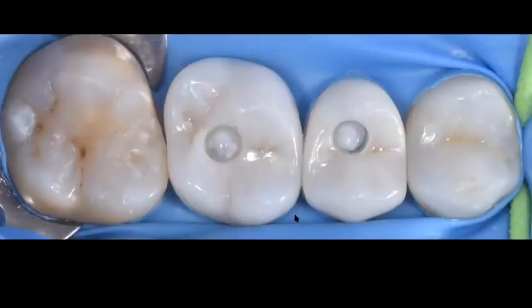So I apply the primer, I leave the primer in contact with the zirconia for 60 seconds or 1 minute, and then I'm ready to add my adhesive layer. I'm going to use an adhesive to bond to that zirconia. So this is going to improve the bonding capabilities of my resin to this zirconia restoration. Is it going to be a perfect bonding? No, but it's going to be a much better bonding compared to not doing anything to the zirconia. So that's the reason why I use that primer.